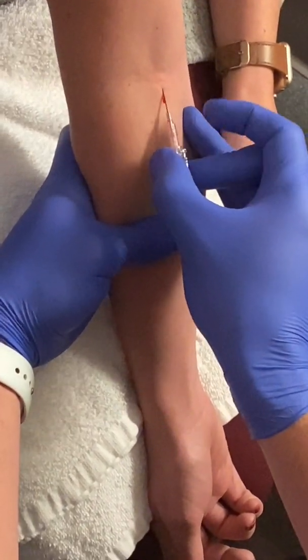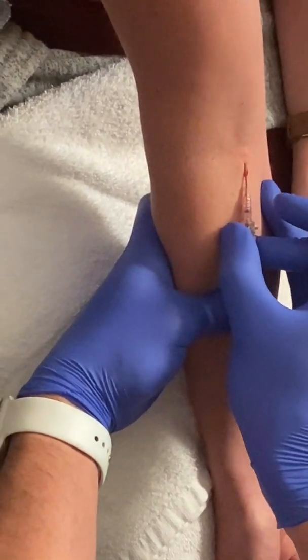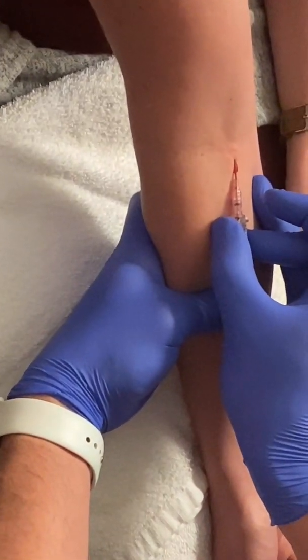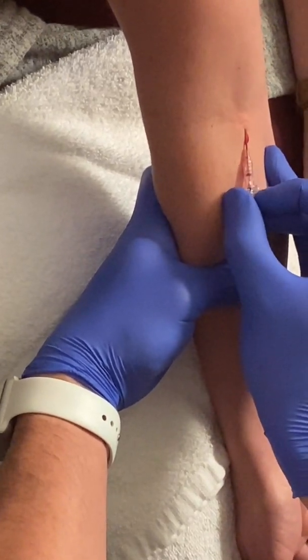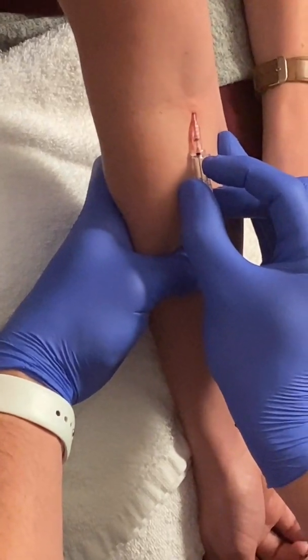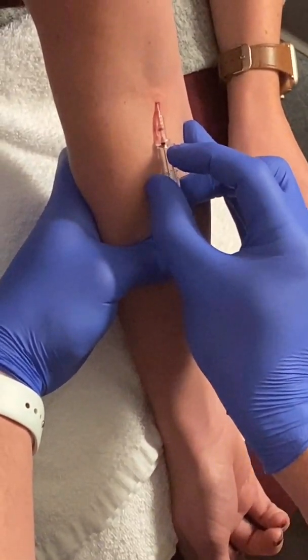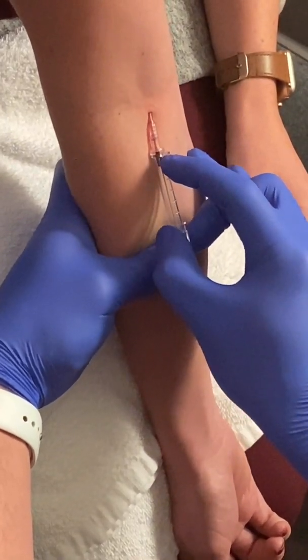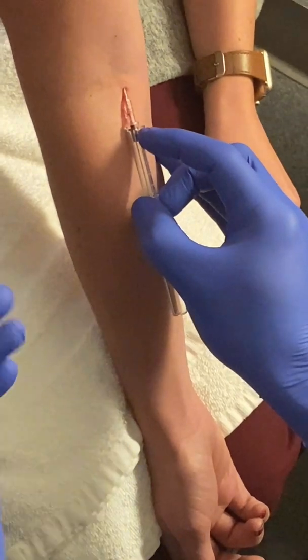And when you hit, you get that flash. Drop it down just a centimeter. Push in just a little bit more. The reason why is because your catheter's not all the way in yet. Once you push in just a centimeter, take your finger behind the hub and thread it all the way up. Once you do that, there are different types of needles. Some are push buttons, some are lock backs. These are lock backs. So you pull back, lock it. Now I can take off my traction because the catheter is completely threaded.